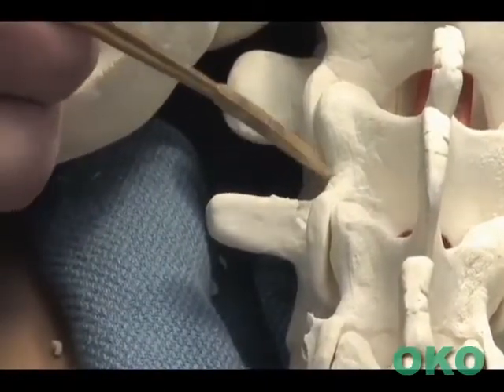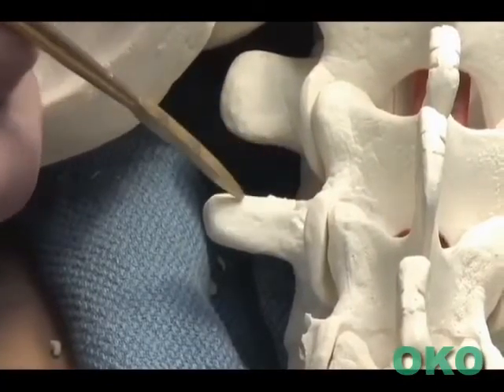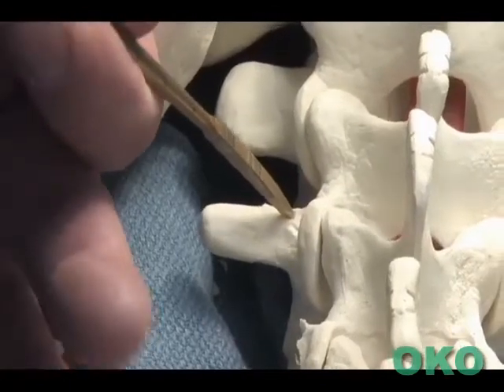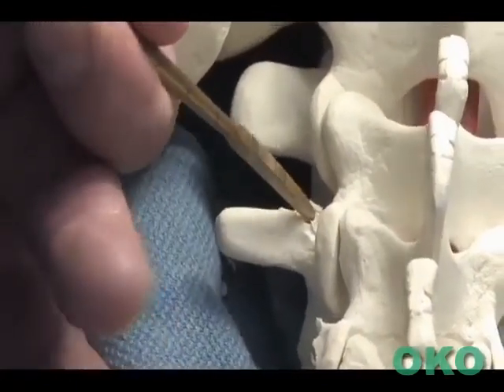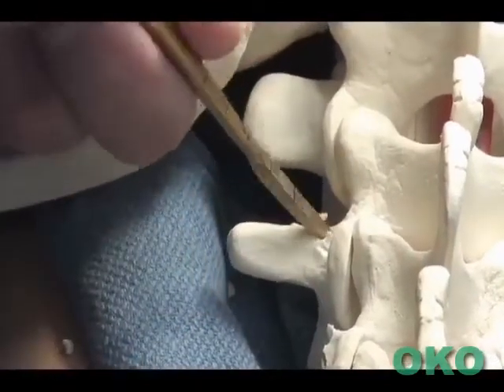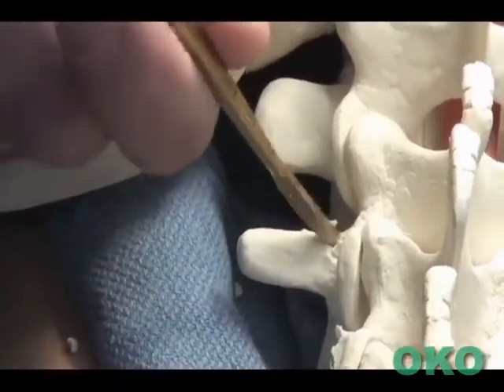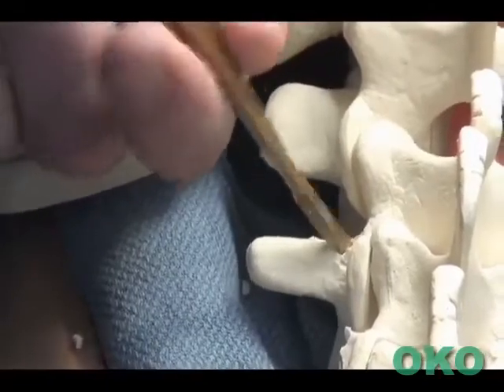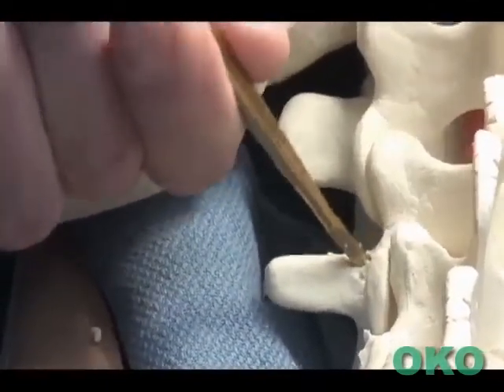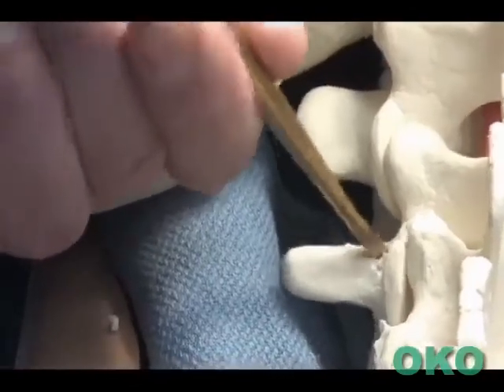Using the lateral border of the pars, intersection with the transverse process, and facet joint as the starting point, the pedicle finder can be introduced in the decorticated path with a gradual twisting motion and gentle downward force, following the cancellous path of the pedicle.